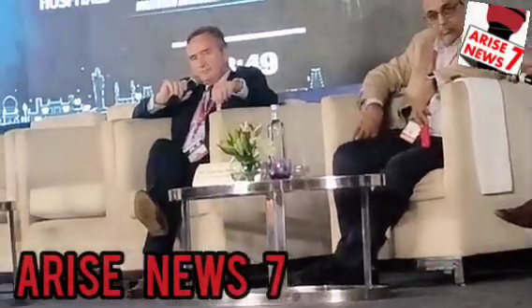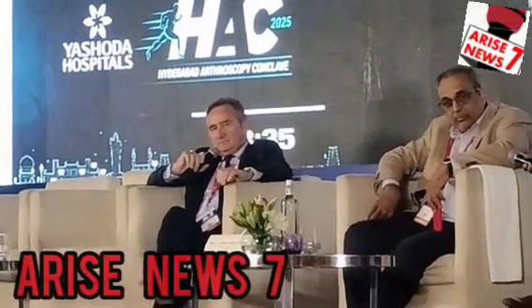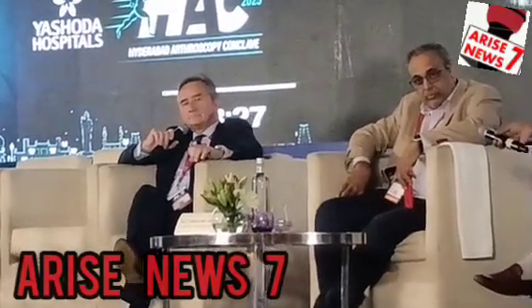It looks like there is a little bit of proximal migration. He has atrophy, supra-infra. It's confirmed, and he has got a full thickness tear of supra and infra. Yeah, so how will you proceed, Philip? This is the biceps. He has a cyst. Remember, the MRI is showing a small cyst in the tuberosity.